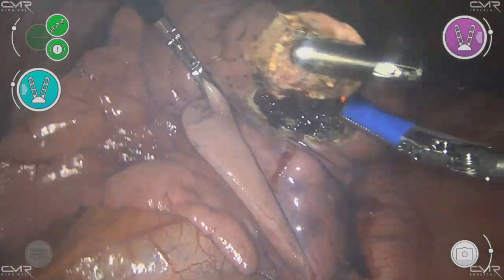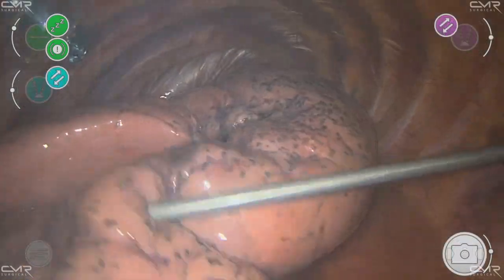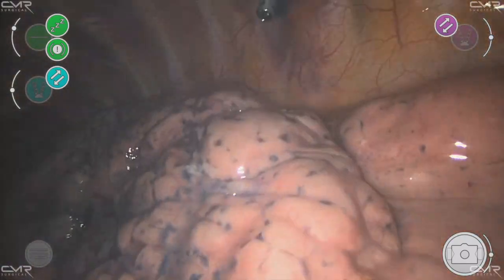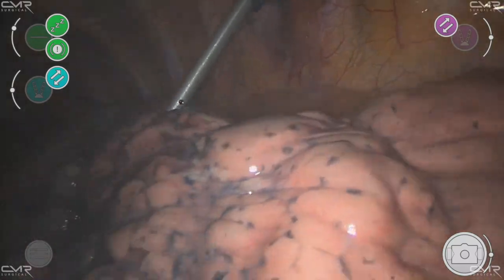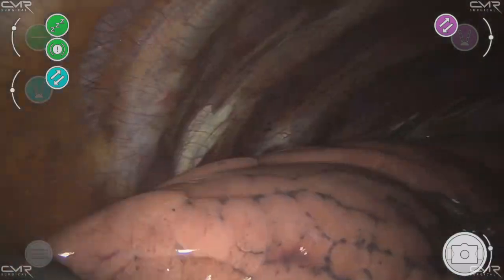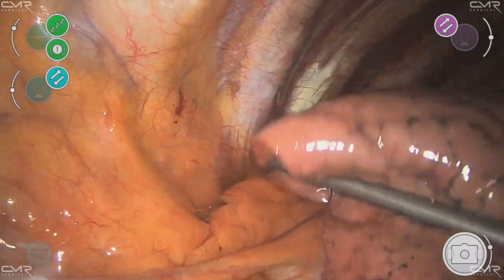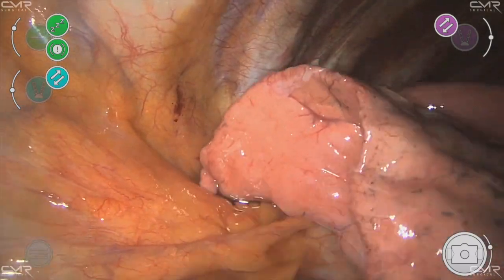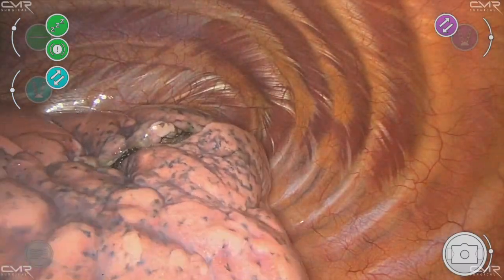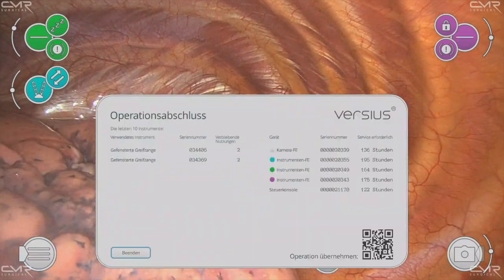You just saw Sven unwind the arm. If you look at the top right icon there is a little half-curve half-moon with a dot - if that retracts to the bottom then you need to unwind the arms. It is very easily done with a long press on the hand controls. And that was the end of this operation - just suctioning to get rid of the fluid, having a look around and checking there are no other nodules. A really nicely done operation. One drain stays in overnight and then comes out the next day. And that is the conclusion of that operation.